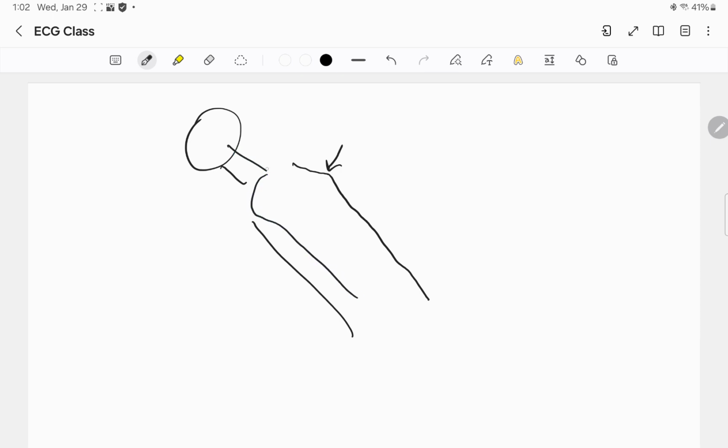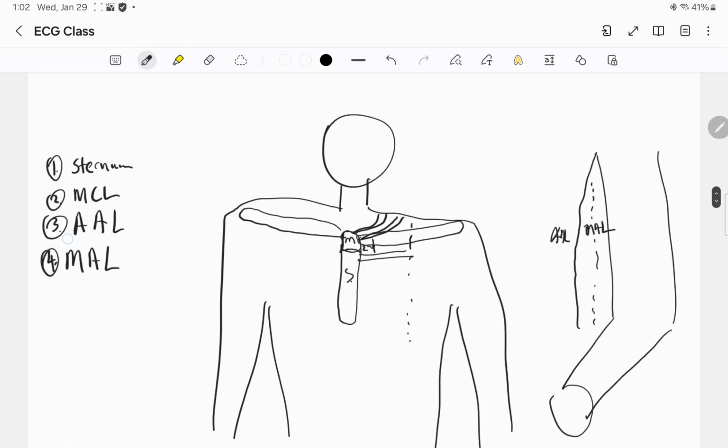So if I'm looking at somebody's chest sideways, that's how the joint looks, right? So I can press there and then just go to the side, and I'll be able to find the second intercostal space, right? Let me draw a nose. Cool. All right, so let's go back up.